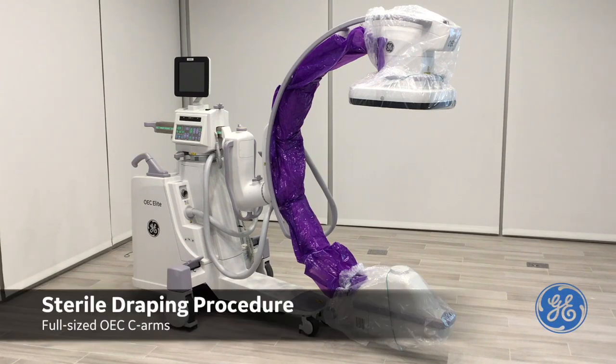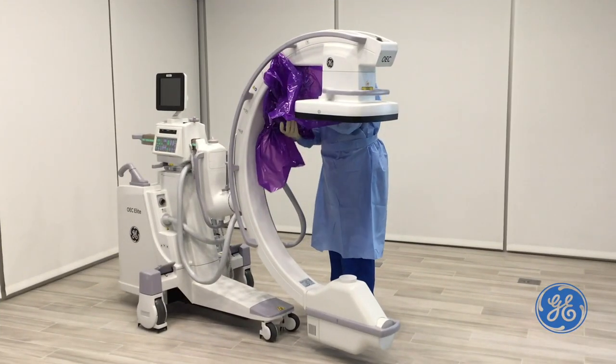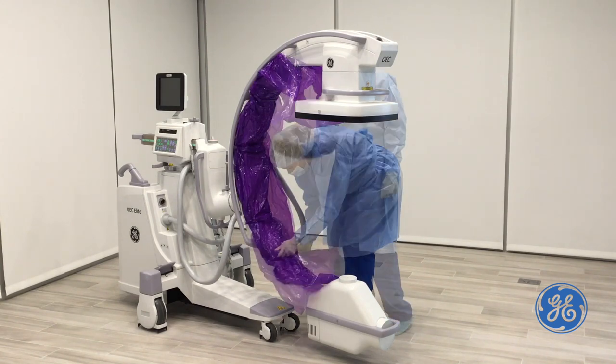The objective of this video is to demonstrate the proper procedure for placing a sterile drape on full-sized OEC C-arms. First, apply the large drape by snapping the clips on the drape into the groove on the side of the C-arm.